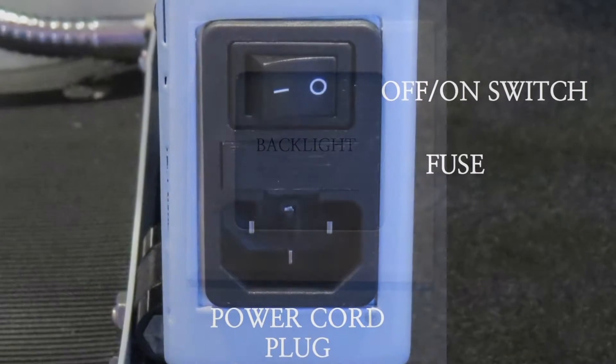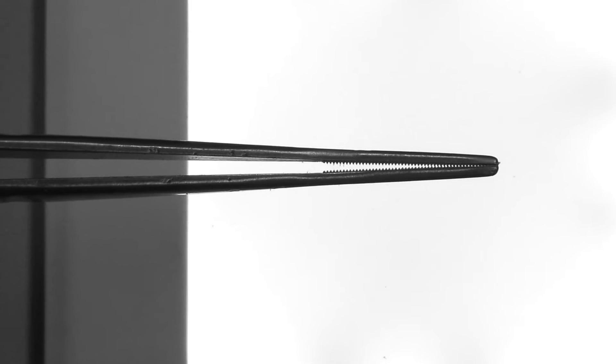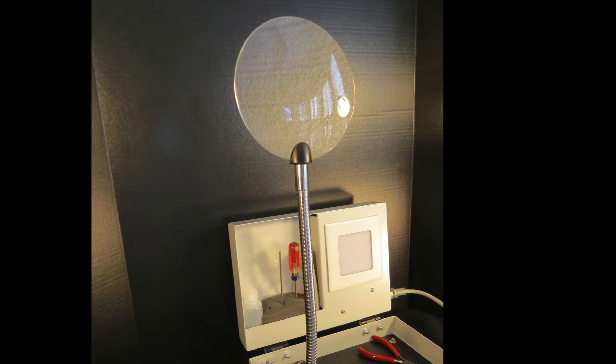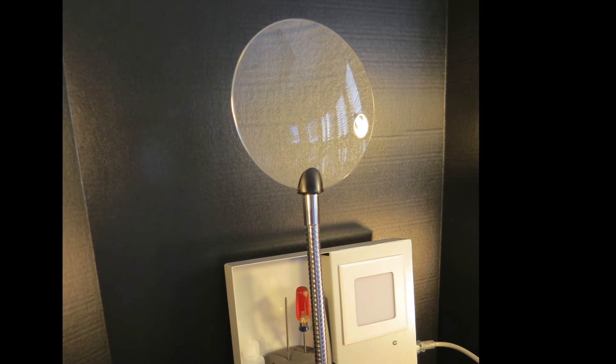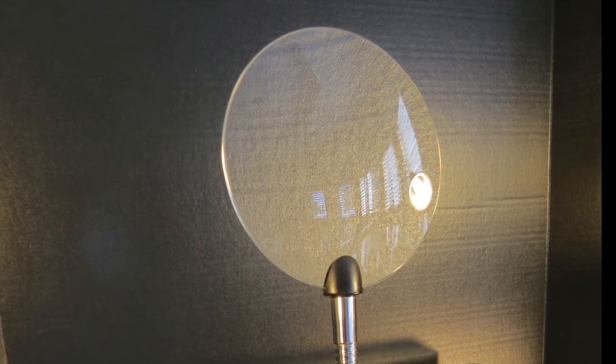Backlight: This LED light, operated by an off-on switch located on the side of the unit, is used to backlight surgical instruments for inspection. The magnifier is mounted on a flexible arm and is used to inspect surgical instruments for flaws and to assist in proper alignments.